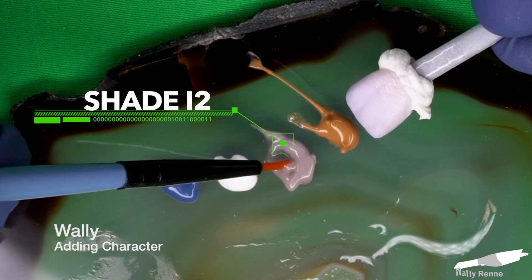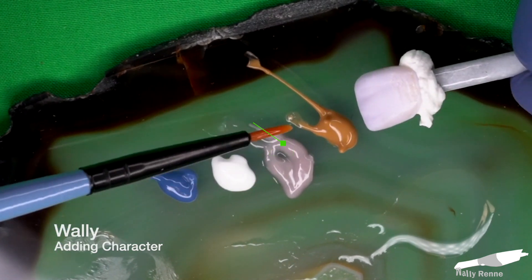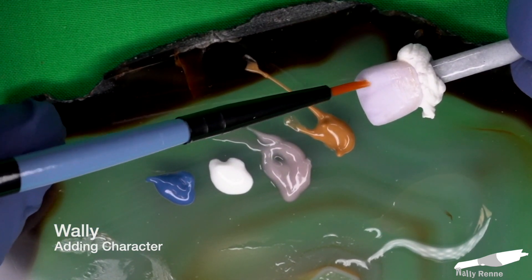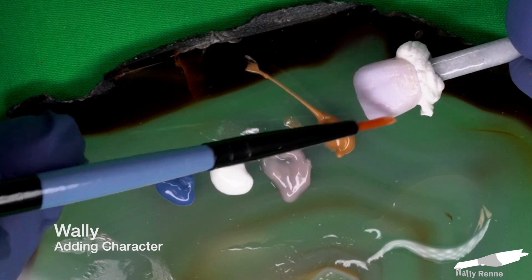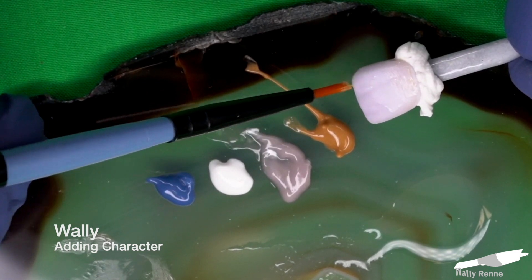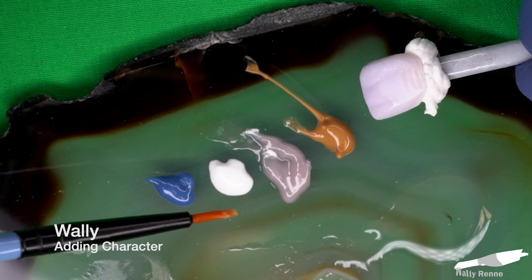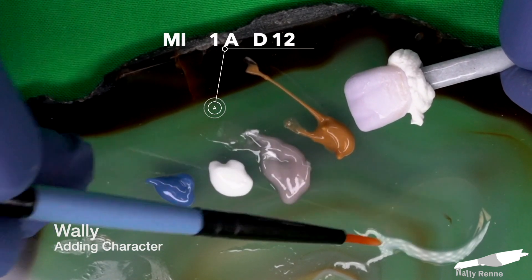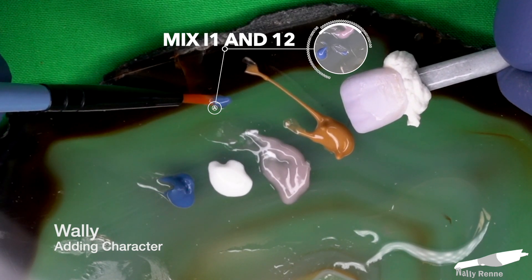Now I'm thinning out this I2, which is a gray color — making it the consistency of yogurt — and I'm adding it to the incisal third in a very rushed, unorganized way. You don't want any straight lines or anything like that. It's just a quick and frantic brushing of that material down super fast. This whole process should take no more than 30 seconds in reality — I'm just slowing it down for you here.